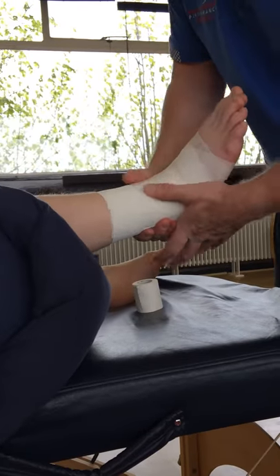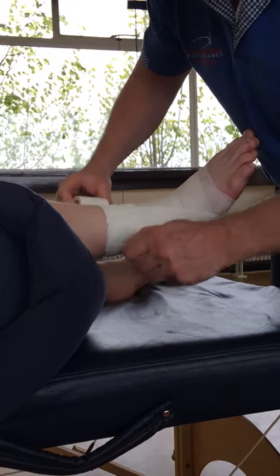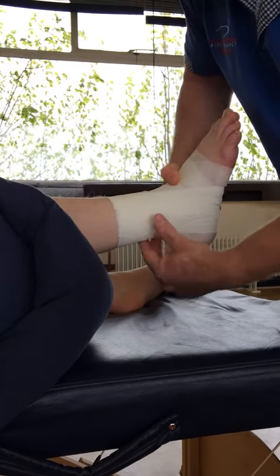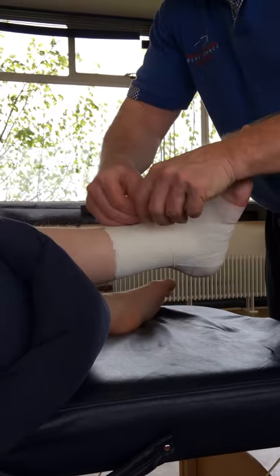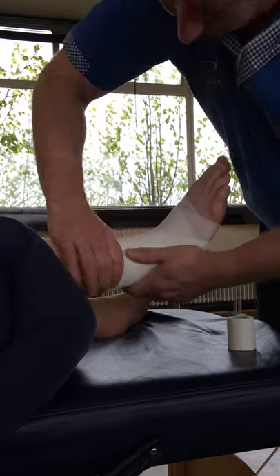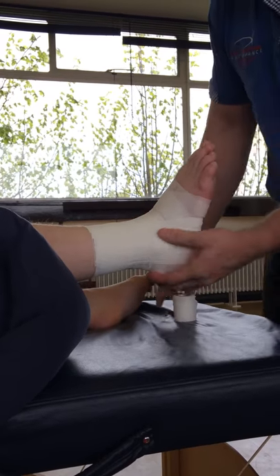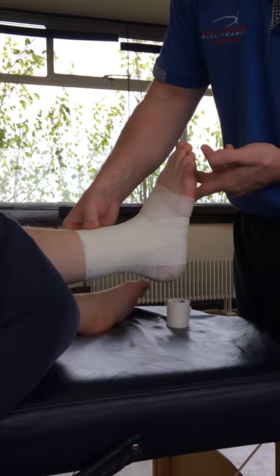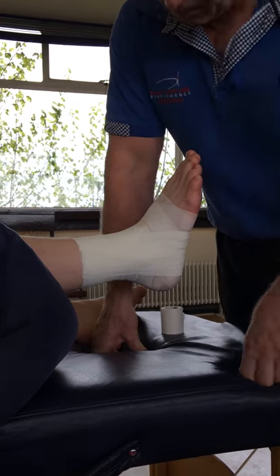Once all that is in position, you're going to lock it up, starting high again. That would be a very simple PowerFlex Power Tape system, and we've done the stirrups. Make sure that the foot does not change colour, as it can feel quite tight.